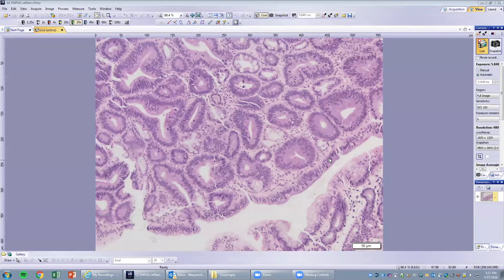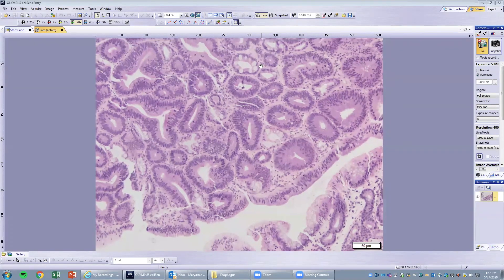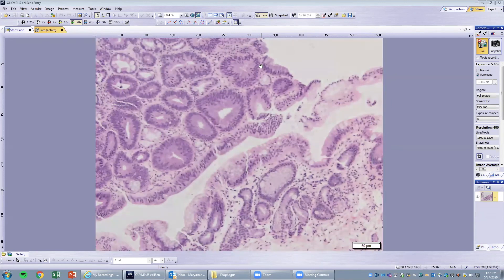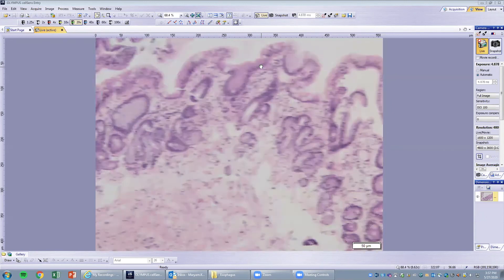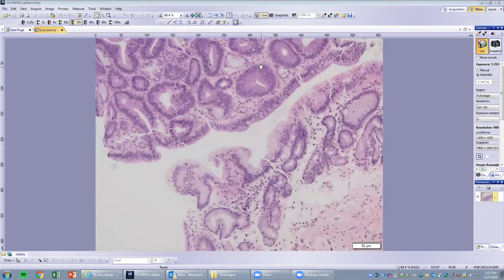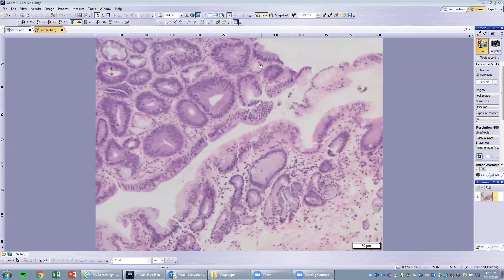As you can see, the nuclei are cigar-shaped, elongated, and stratifying. The mucin no longer exists at the surface. This is an example of low-grade dysplasia arising from Barrett's esophagus. We always report these findings so patients can get proper follow-up and treatment.